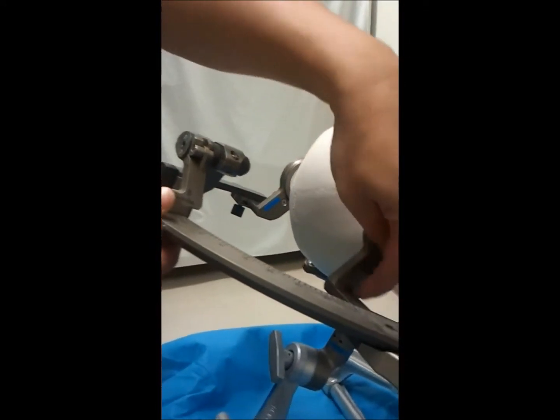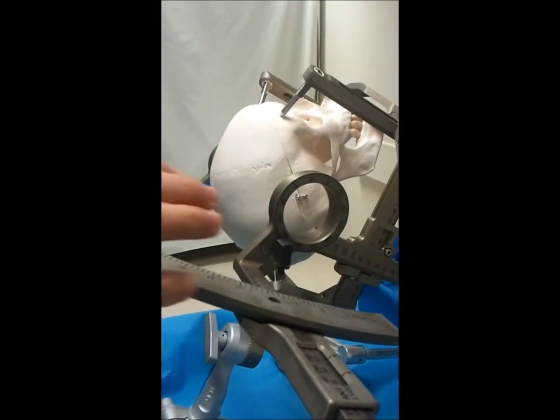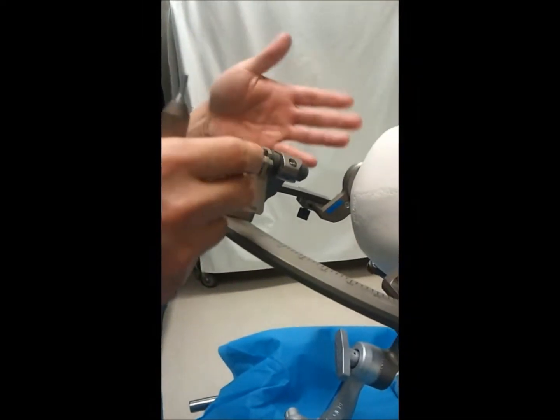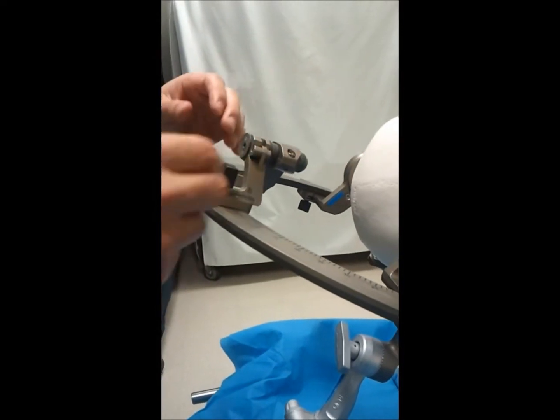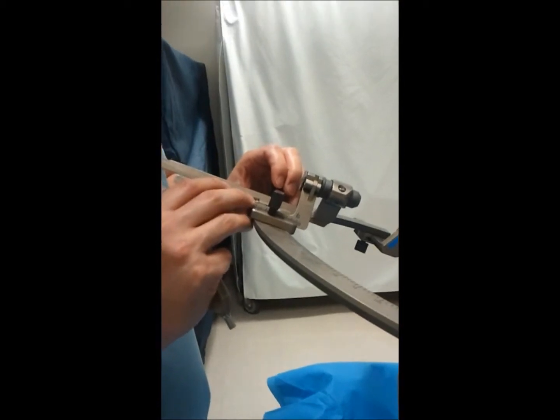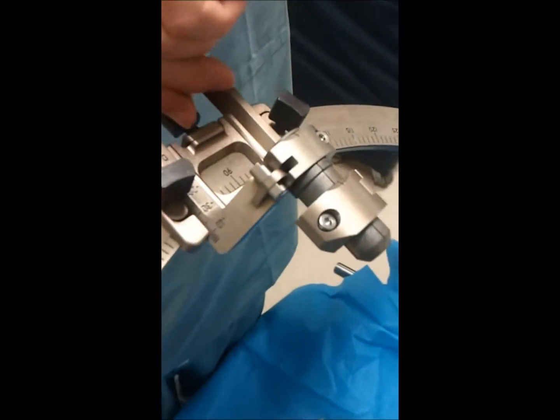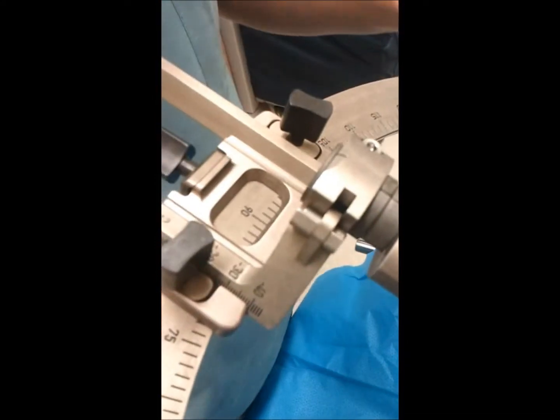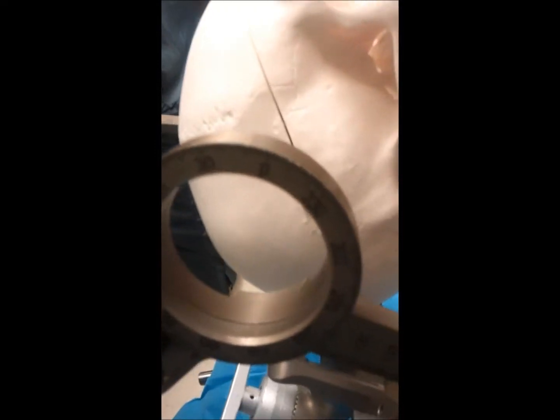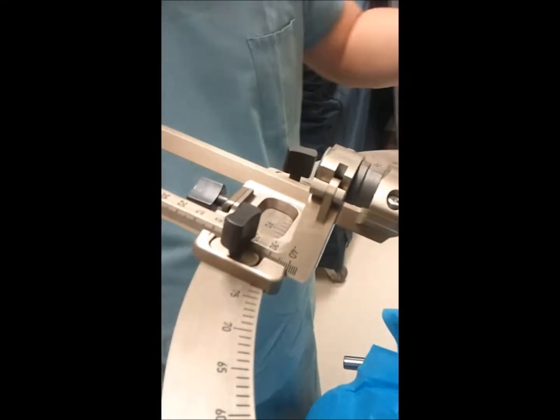If we need to test our target point, and let's say we did 90, 90, 90, obviously we don't want a straight 90 here normally because we'll go through a superior sagittal sinus, but for this demonstration we can today. So we can, if all our coordinates are appropriate, go to a 90 arc, and again the arc is an arc versus the ring is a total ring here if you forget which one is which. What we can do now is check our targeting.